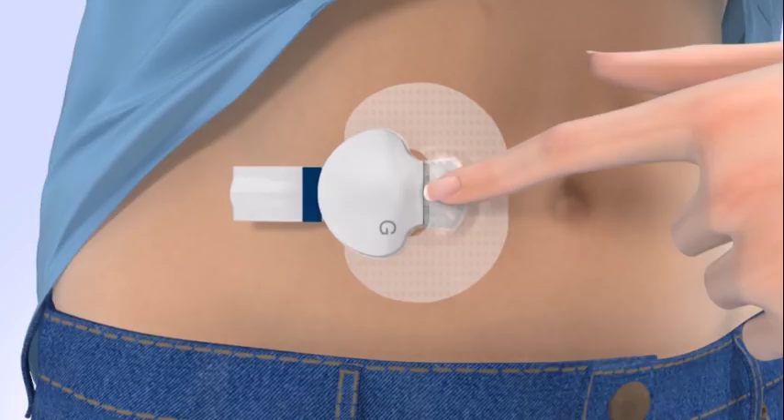The green light on the transmitter will start flashing within a few seconds. It will flash for a few seconds and then turn off. If necessary, use a mirror to see the green light. If the light on the transmitter does not flash, disconnect the transmitter from the sensor and place it back on the charger until it is fully charged. Reconnect the transmitter to the sensor.